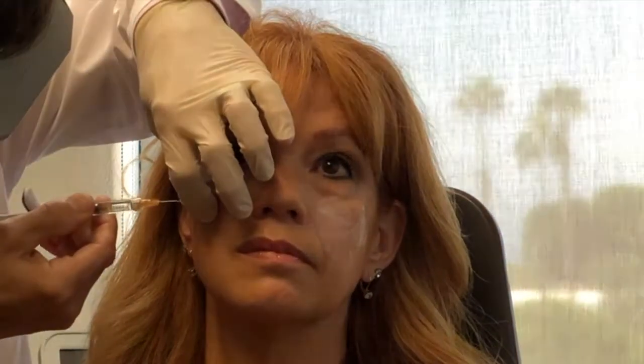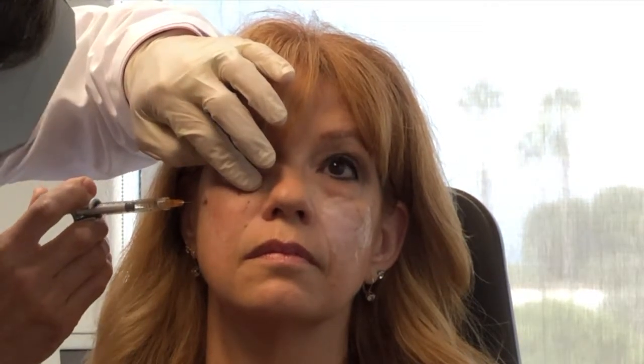We still need a small volume in the area of that infraorbital vessel. We are seeing the shape of this cheek now coming to its desired appearance. I will try and come from my lateral incision, tenting up that tissue, allowing the cannula to fall into the desired plane, aspirating to confirm no fluid or blood, and maintaining compression on the potential end artery that we want to protect — a very nice improvement in that cheek.